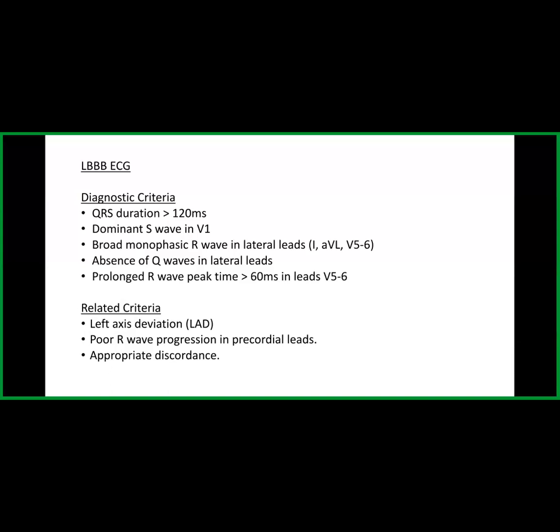What do we expect to see? What are the differences of a left bundle branch ECG from a normal type of ECG? So basically, in a left bundle branch ECG, we can appreciate a QRS duration of greater than 120 milliseconds.